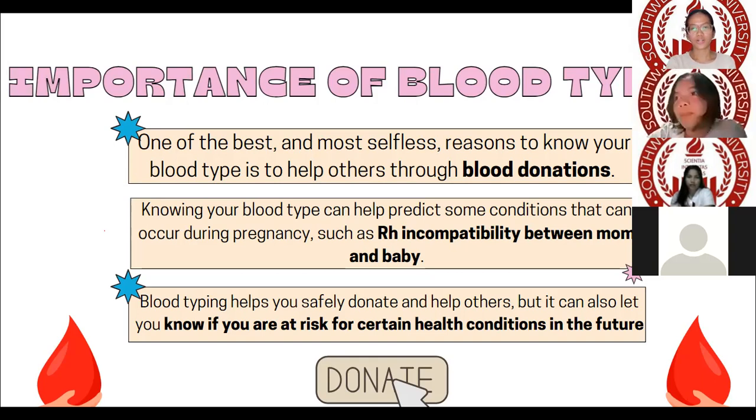Okay, thank you so much for that, Miss Asuke. And now the last part of our discussion is the assessment. We will be testing you on how to read the different blood types as presented in our anti-sera antigen reaction.